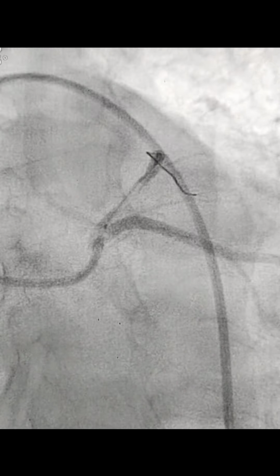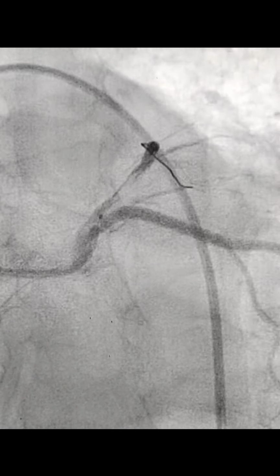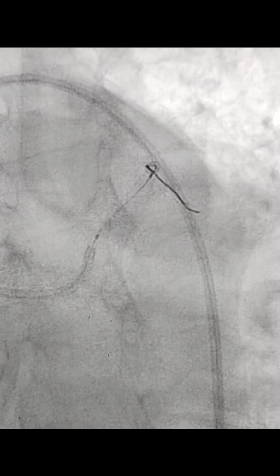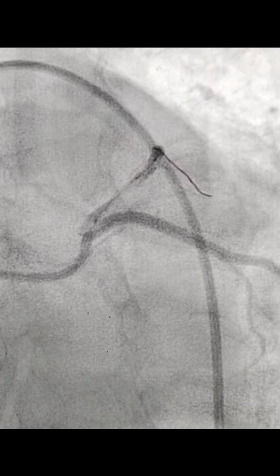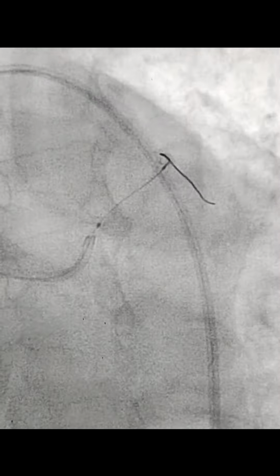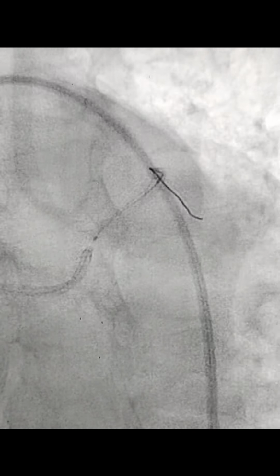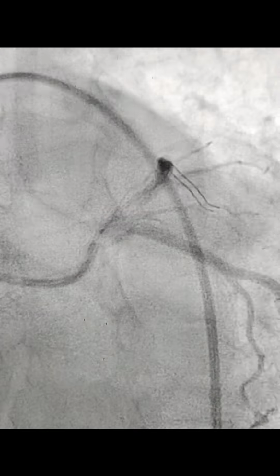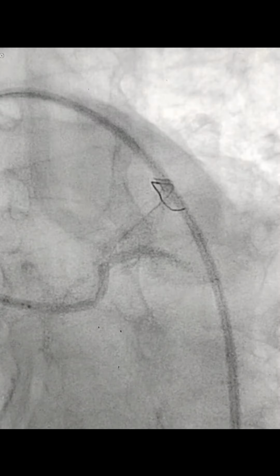This is the caudal view, and we wanted to deploy the stent from the ostium of the LAD to the mid LAD, and then we will overlap. It was a difficult task, because we don't know the exact origin of this LAD.